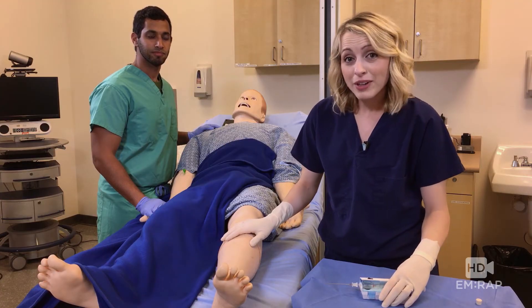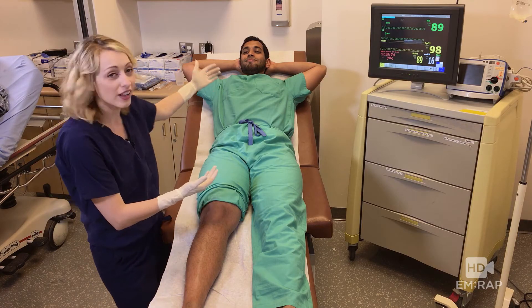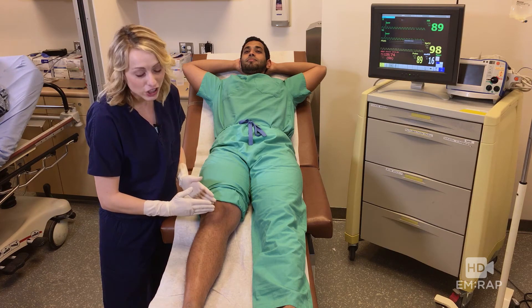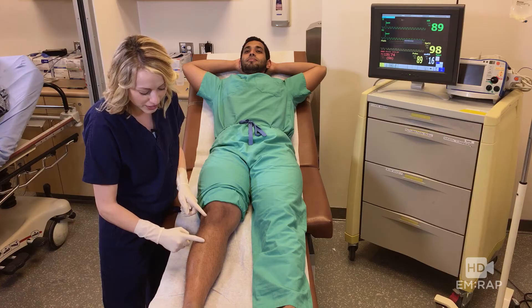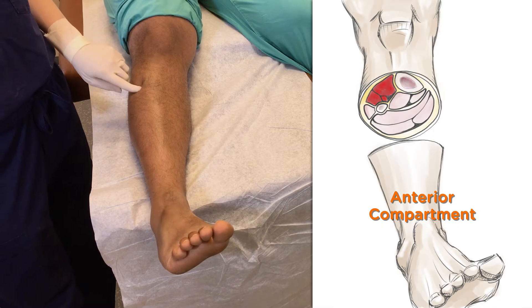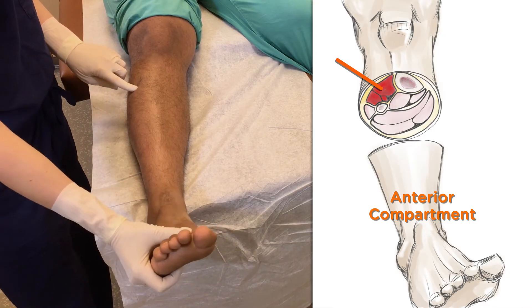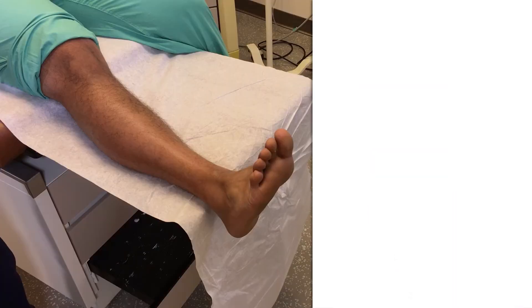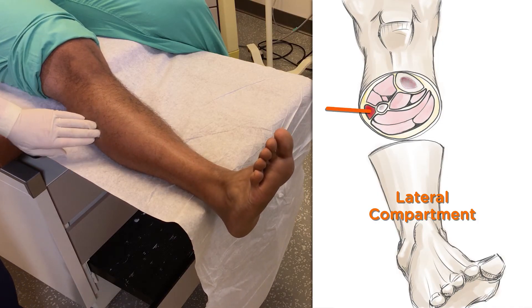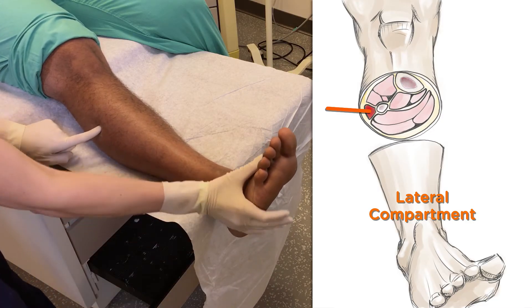How about now we review the anatomic compartments? The lower leg has four compartments that Dr. Hamoud has volunteered to help us demonstrate. For all of the compartments, you're going to go at the imaginary cross-sectional line about one-third the way down the tibia. For the anterior compartment, palpate the tibia and go one centimeter laterally — insert the needle one to three centimeters deep, and the pressure should rise with plantar flexion of the foot. For the lateral compartment, palpate the posterior border of the fibula and insert the needle just anterior to this, aiming right towards the fibula. Go about one centimeter deep and the pressure should rise with inversion of the foot.